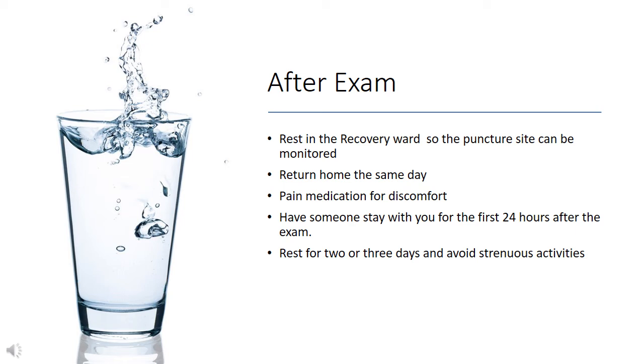After the procedure, you will be taken to the recovery ward where the arterial puncture site will be closely observed for a period of 6 to 12 hours. Usually you can return home the same day, although you may need to stay at the hospital overnight.